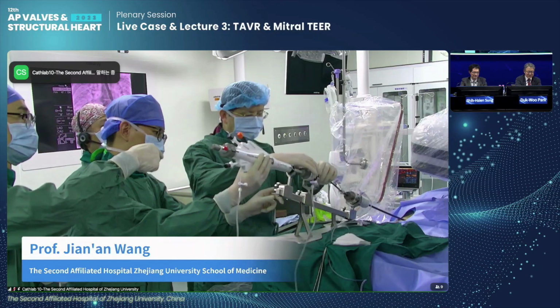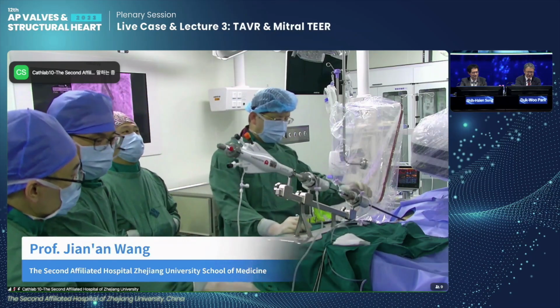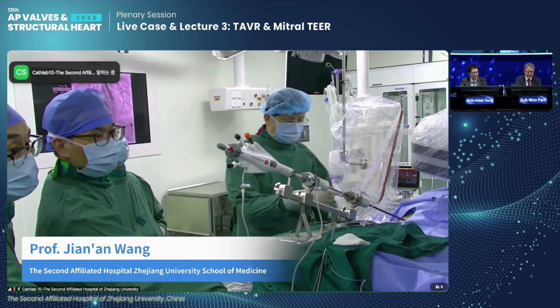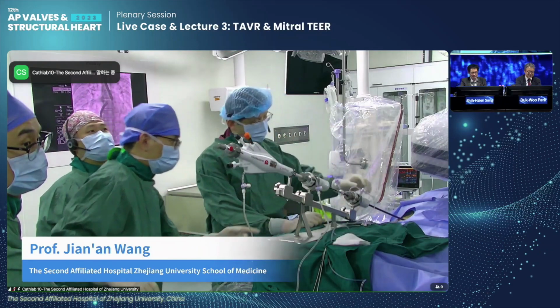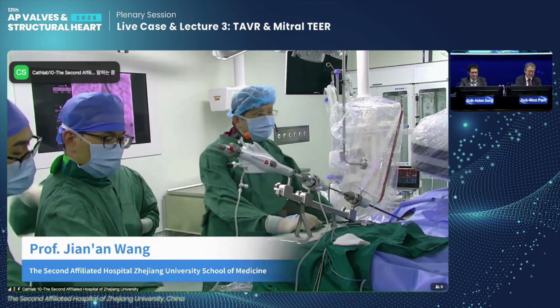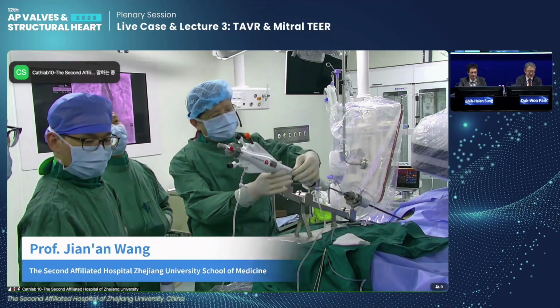The patient is an 87 year old gentleman. The patient has had symptoms for over 3 years. The patient has a history of hypertension and PCI. Next one, please. And the patient is a symptomatic DMR patient.